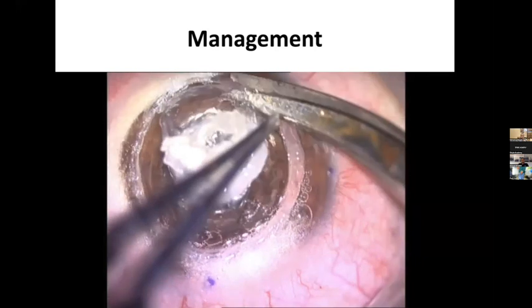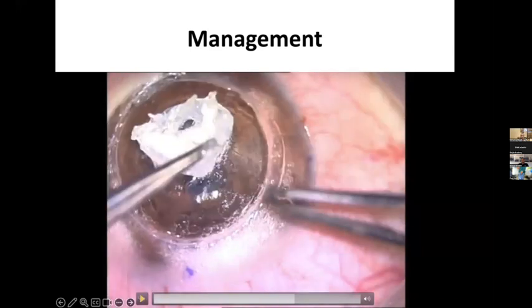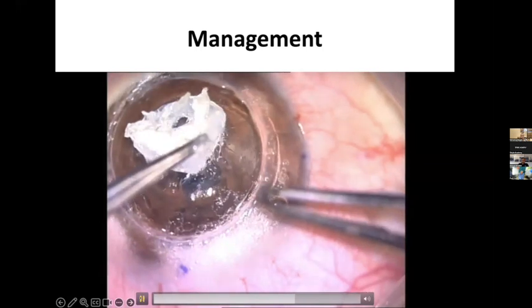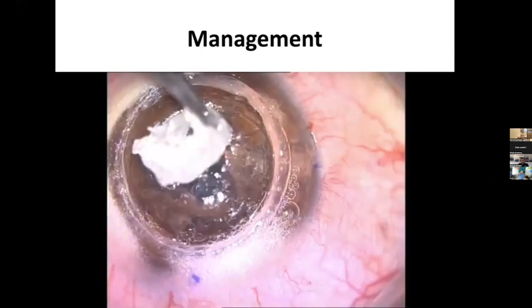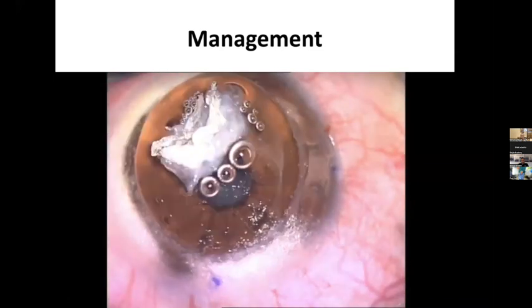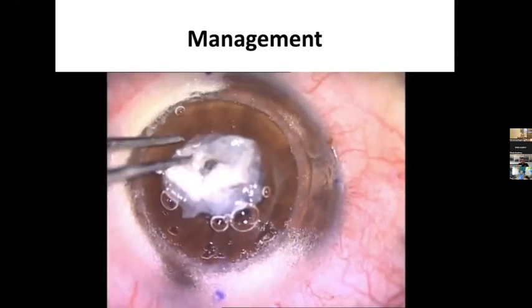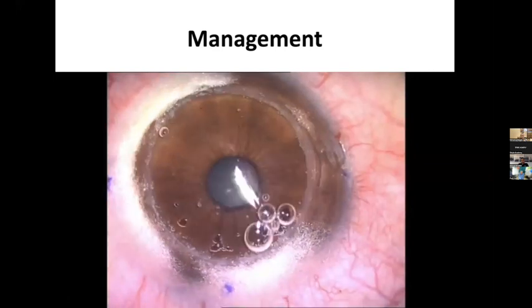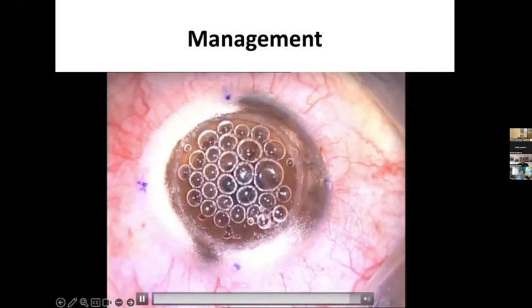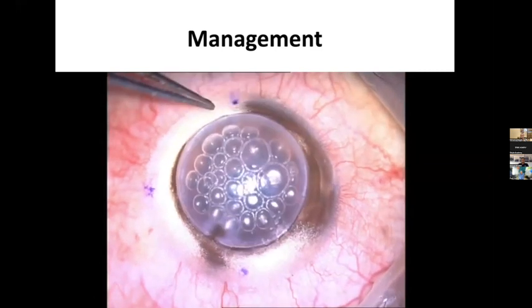And now I'm feeling that I reached a good plane. Try to peel the center. I know now that there is a perforation and I'm expecting the perforation, doing peeling carefully from all directions. And when you find the perforation, do not panic. Although there is some collapse of the anterior chamber, continue the peeling from other sides so as not to extend the tear. And you'll find that this was caused only by a small tear, and the bubbles in the anterior chamber can be kept, and you can continue DALK safely.